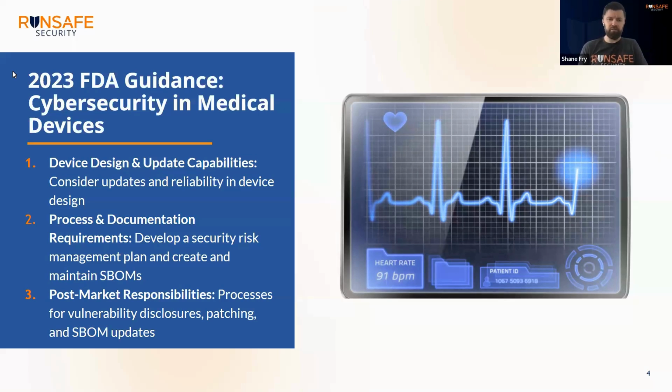So if you don't have that software bill of materials, you don't know what vulnerabilities are known and already present in your software. And we see this all the time with development teams that have a Linux distribution from 10 years ago that they're updating their software, but they're not updating the Linux operating system underneath it. And you can have a ton of vulnerabilities there, and they're just not tracking them. And so that's a huge problem.